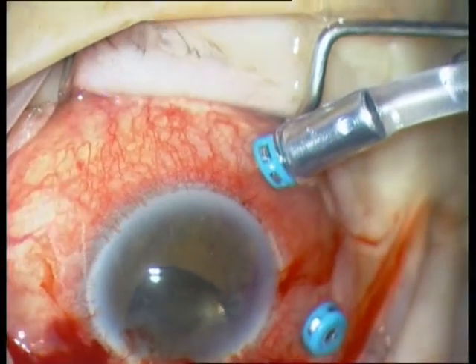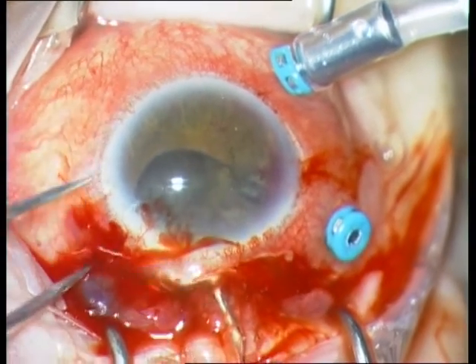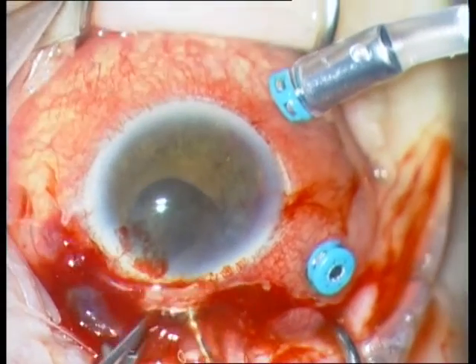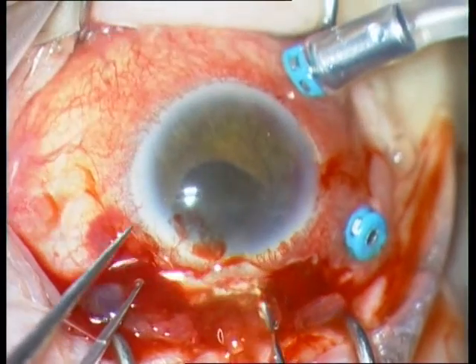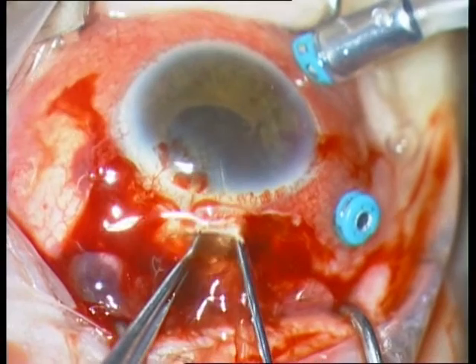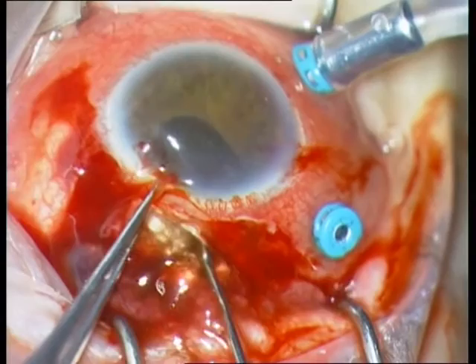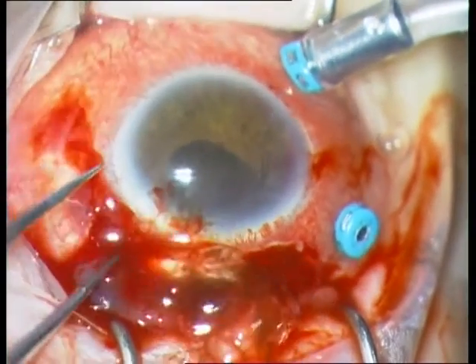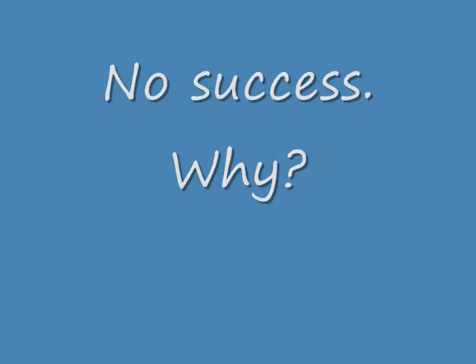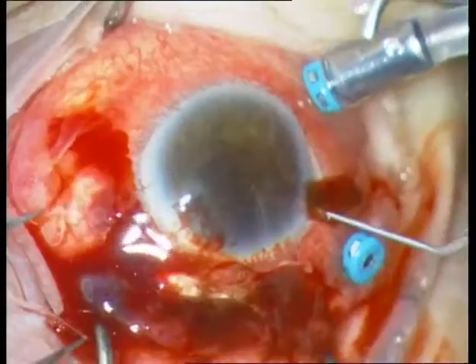But in this case it gets very difficult. I'm getting some help with the Kustavail forceps and I don't know why the extraction is so difficult. Important: do not use force now. The IOL is obviously stuck. So why is there no egress? Is the scleral incision too small? Are there posterior synechiae or something else?